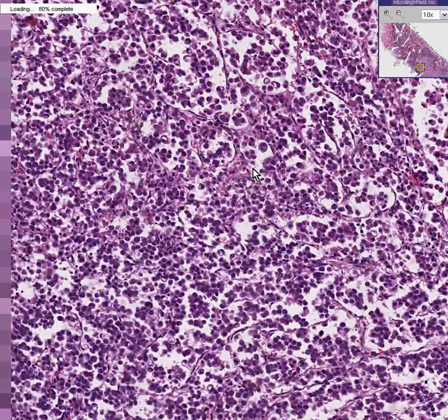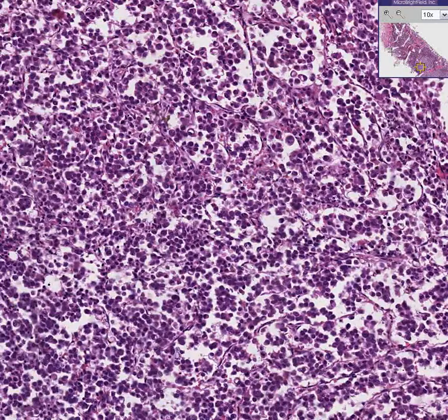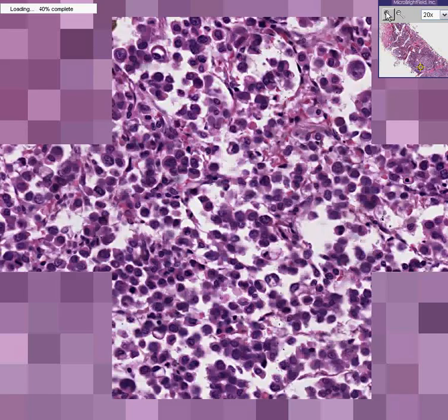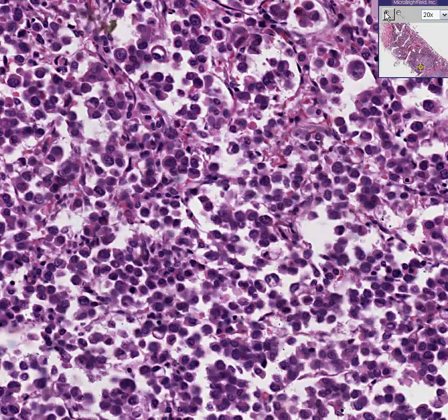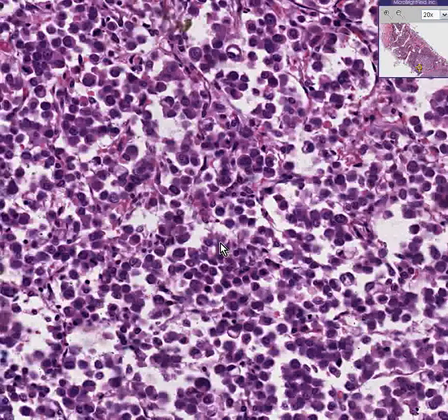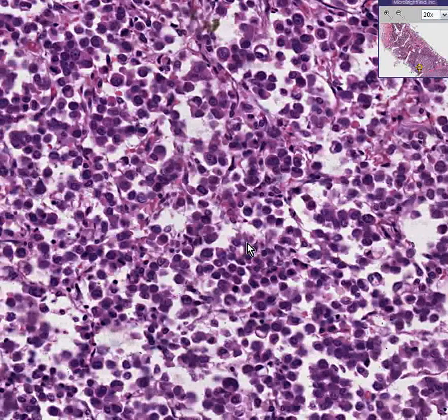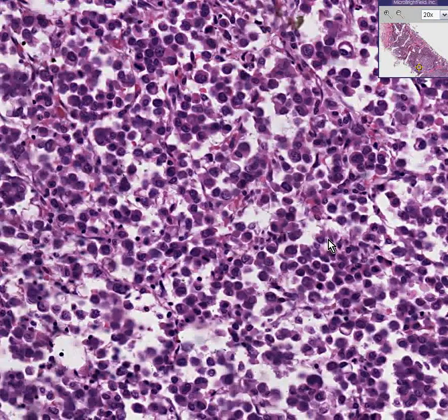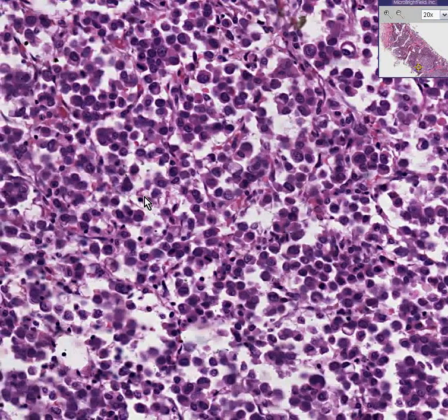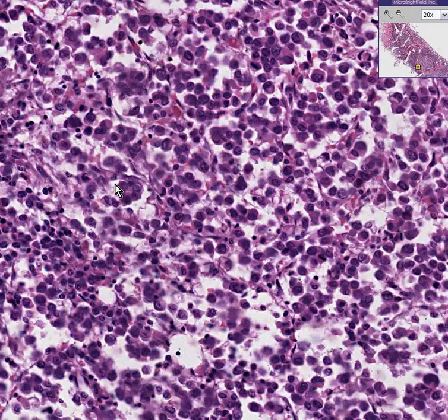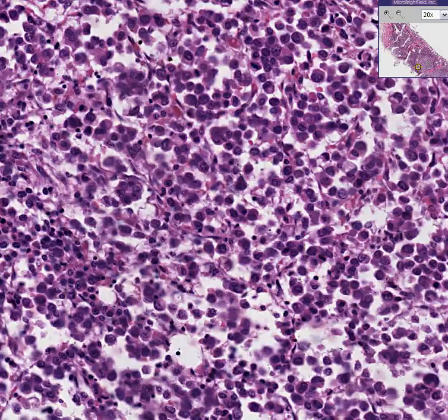They look like rather undifferentiated cells. And they're very pleomorphic. And there's abnormal mitosis. Some of these may be inflammatory cells — lymphocytes. And in this area here, it almost looks like there's a primitive-looking gland, doesn't it?